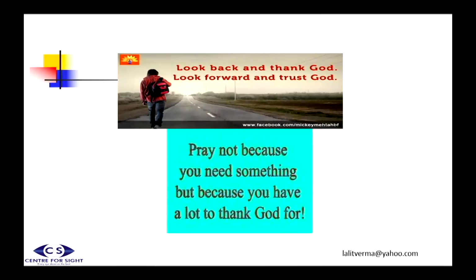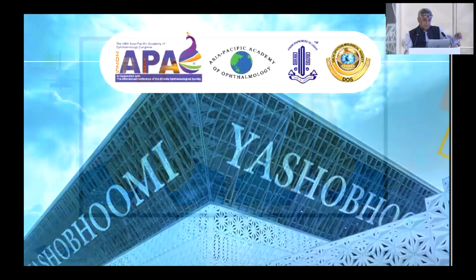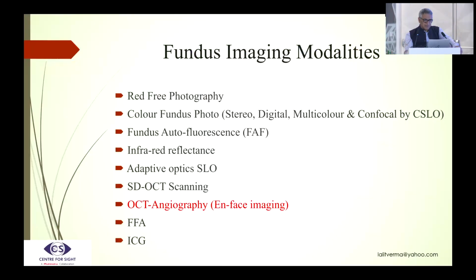Okay, thank you, Avninder, for this very important and evolving subject. A lot of us may not have an OCTA machine, and a lot of us are still learning. Unlike angiography, you have to sit there and spend a lot of time. You can't just depend on the technician to do it and then interpret it. So, welcome to this very nice venue.